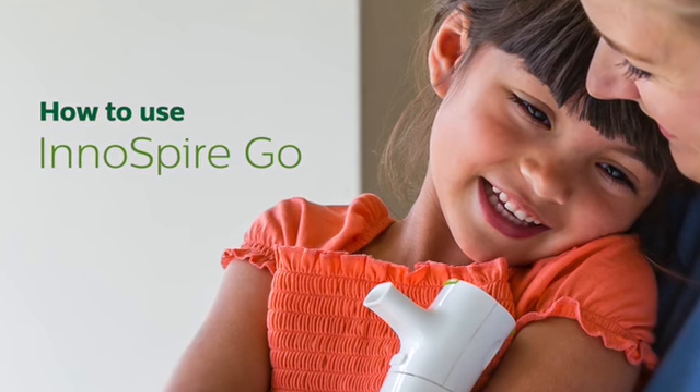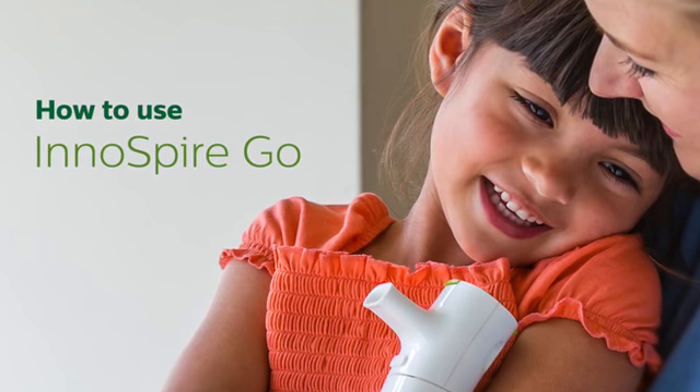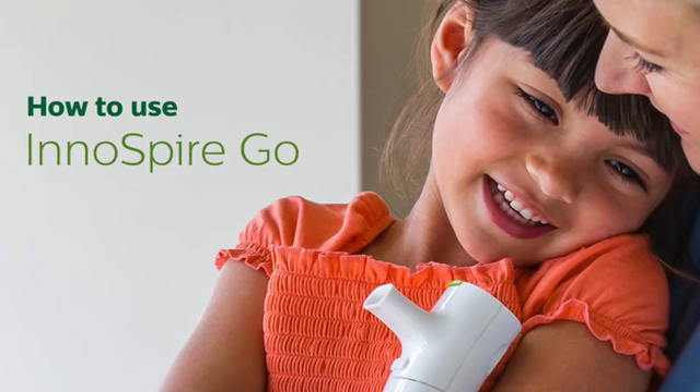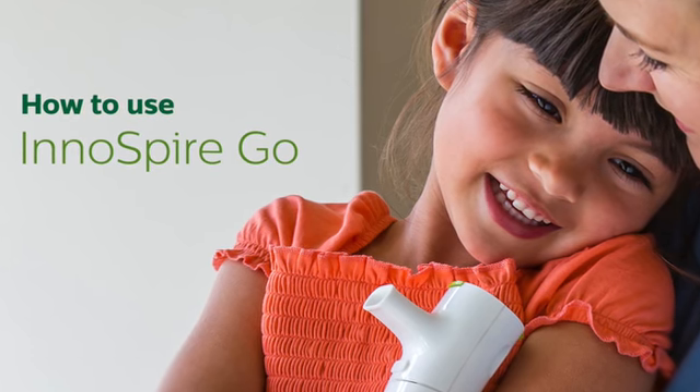InnoSpire Go is a portable mesh nebuliser designed for the treatment of respiratory diseases such as asthma and COPD. It's easy to use and will provide you with quick, simple treatments.